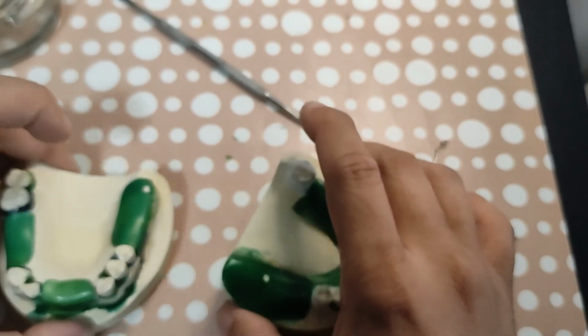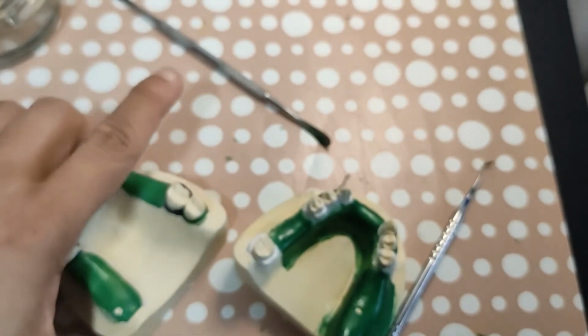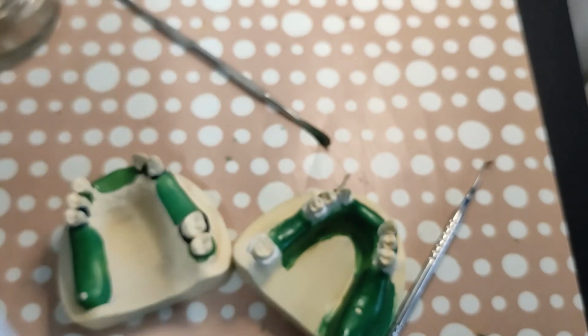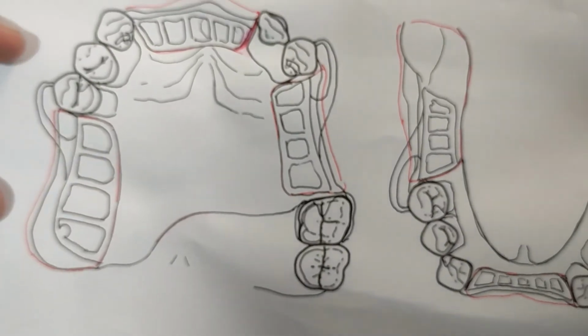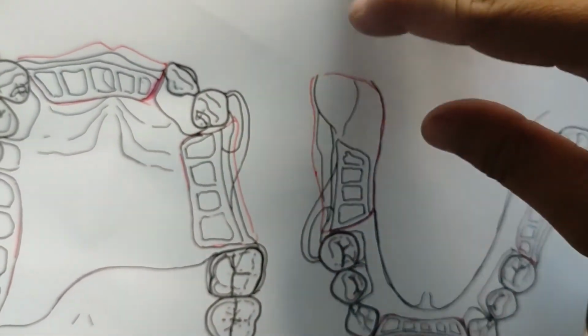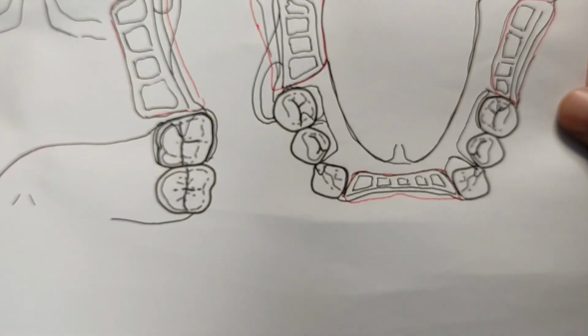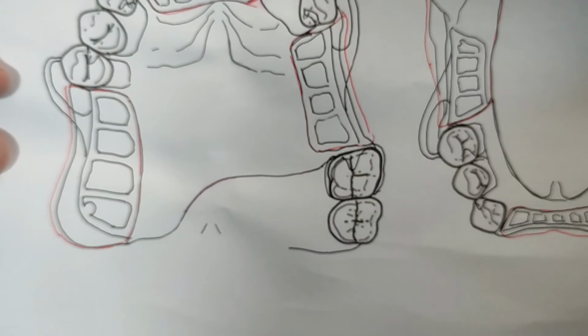Before you go on and take an impression of your cast, review your cast prep and make sure that you have your designs with you, right? Check if everything's covered. See if you have any supra bulge clasps. Do they have shaped blockouts underneath, right?